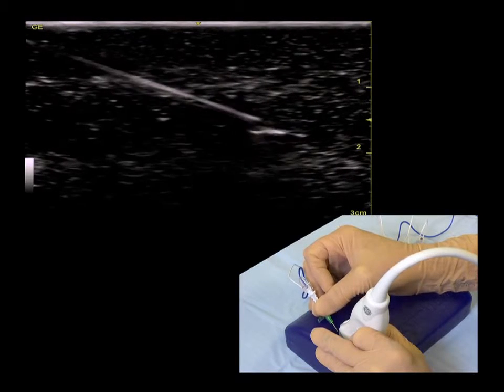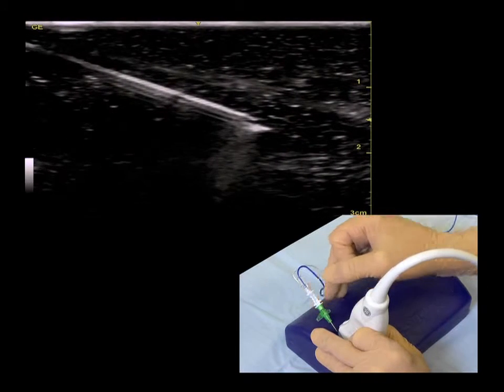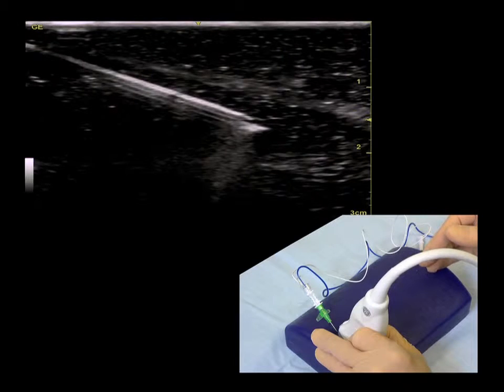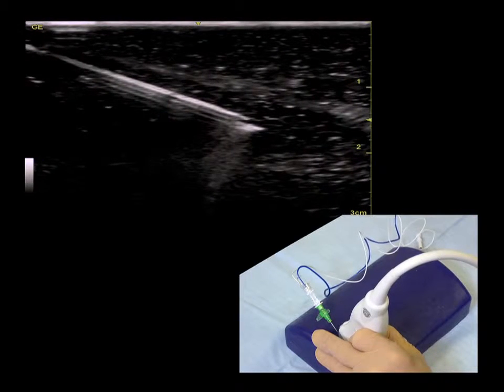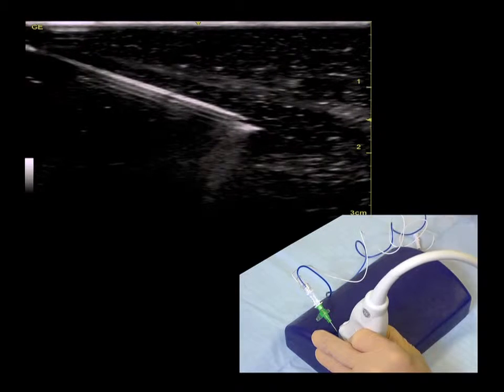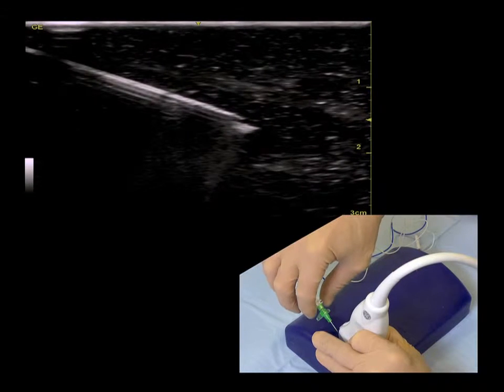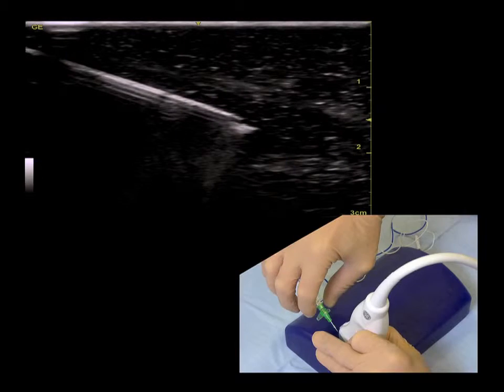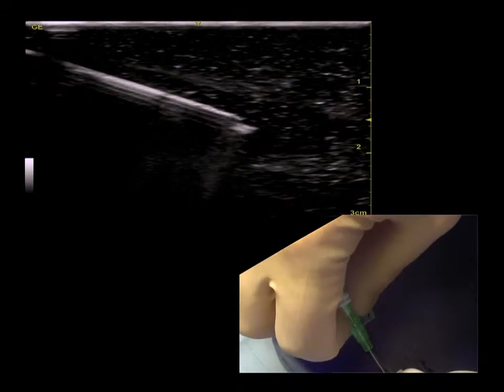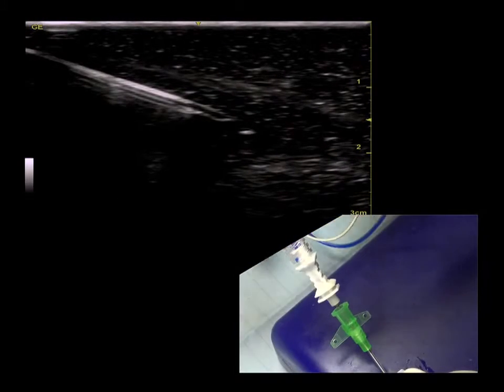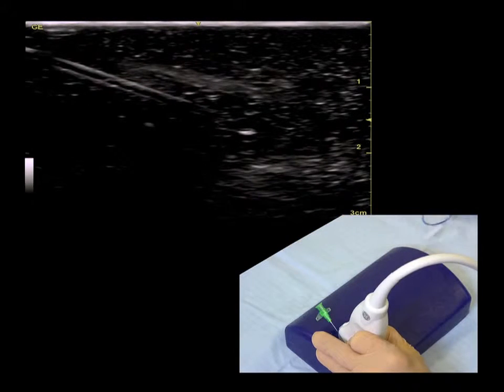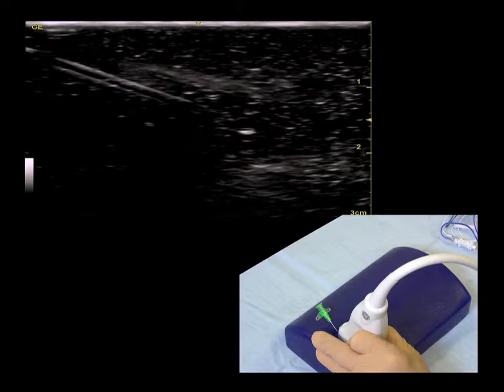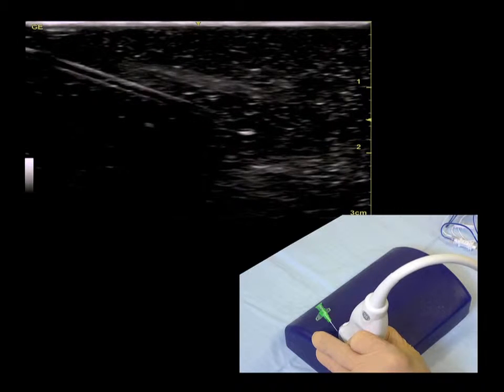Once you are satisfied with the final position of your needle, and you've correctly aspirated and identified your position, you can remove the needle from the sheath. The easiest way to do this is using your thumb and finger to pop the needle out of the sheath. The intrinsic tissue tone will hold onto the sheath and ensure that you get very little movement as the needle is removed from the sheath.